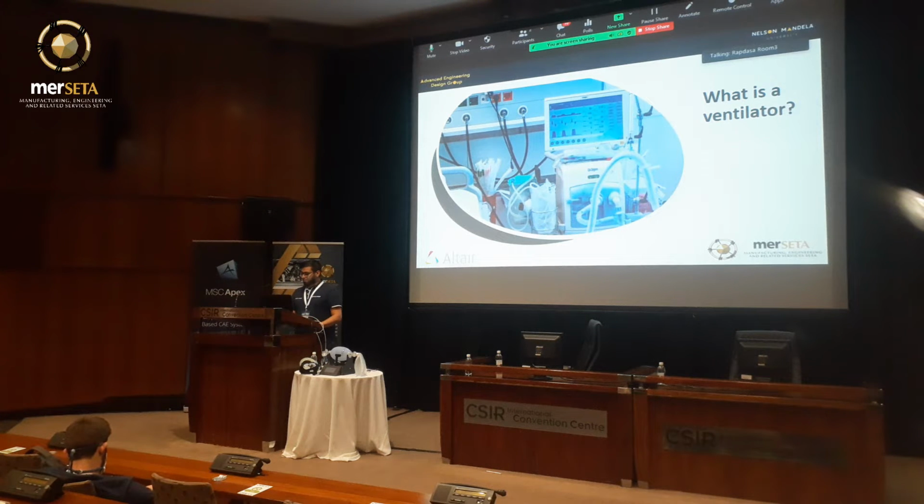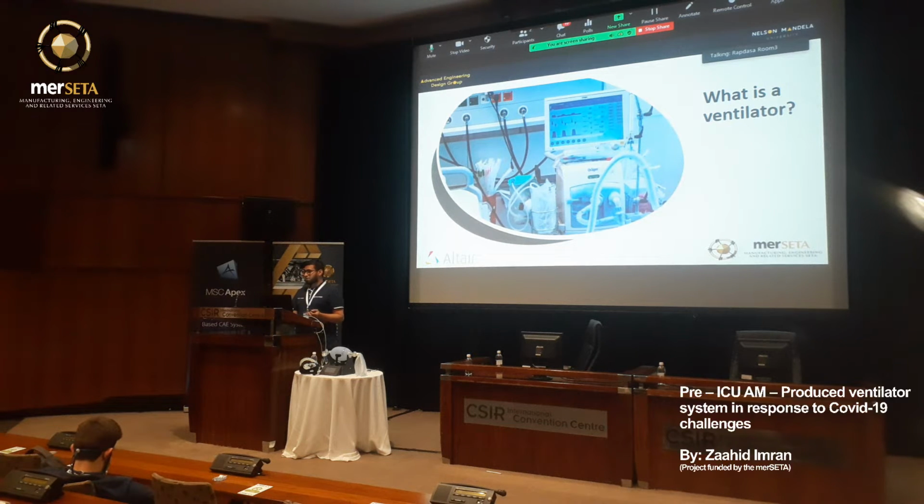When a person's lungs inhale and exhale air normally, oxygen is taken into the cells to survive, and carbon dioxide is expelled from the cells. A patient suffering from COVID-19 in severe cases has an inflamed airway, and this causes the airway to drown in fluids. Therefore, a mechanical ventilator in this case helps get oxygen into the lungs at a rate required for normal breathing.